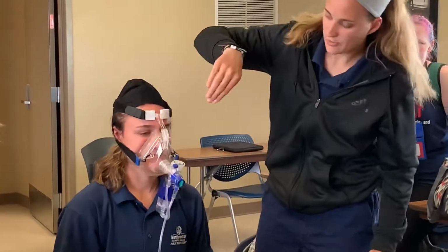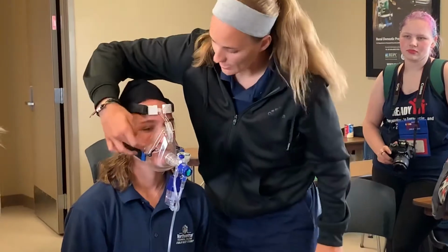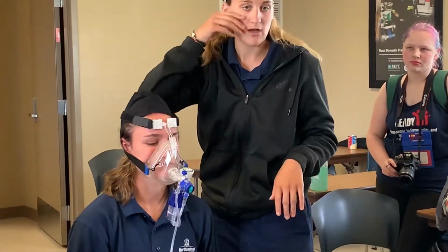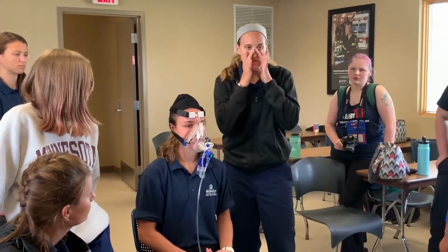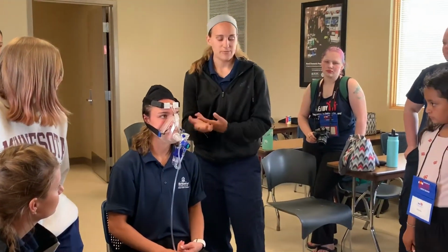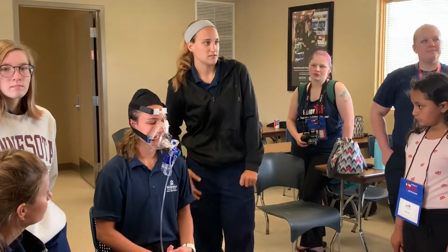Sometimes when you apply it, the air will leak out of these areas around their cheeks. So you'll want to ask them, do you feel air escaping or feel air coming in? When you have the mask on, you can feel where air is leaving, and the better suction you have, the more oxygen they will receive. Then you will keep it applied to their face until you get to the hospital, obviously checking those vitals.